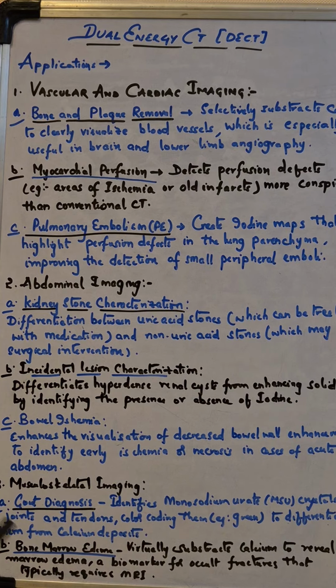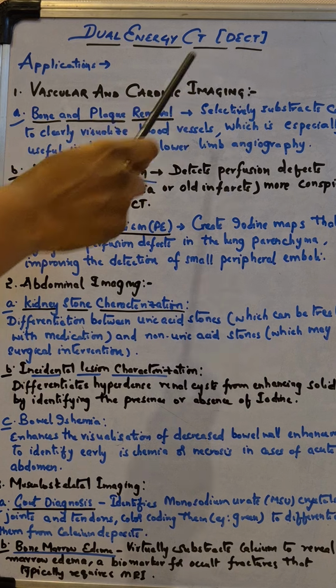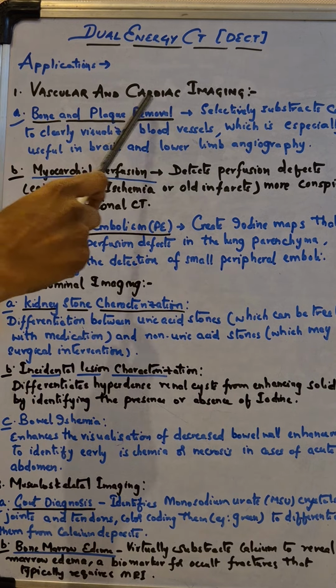Good morning, everybody. Today we'll be discussing applications of dual energy CT. So first one is vascular and cardiac imaging.